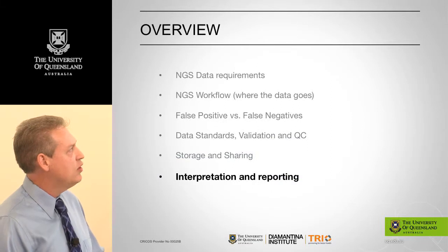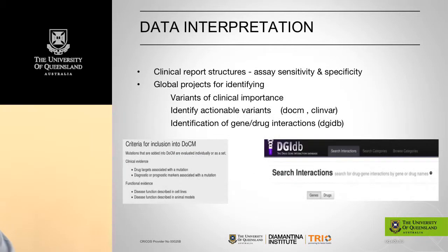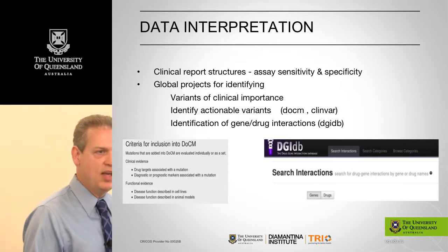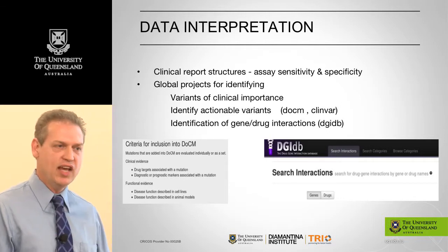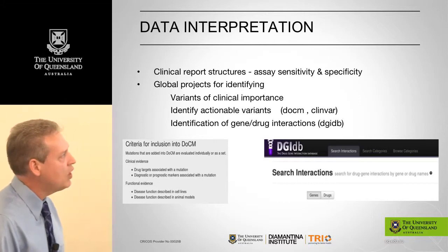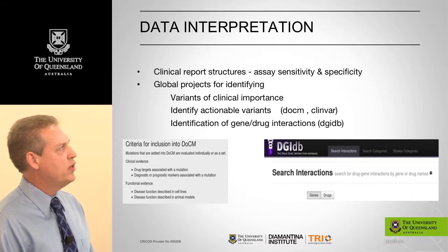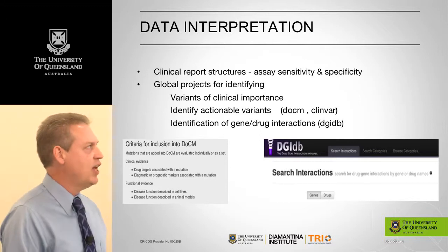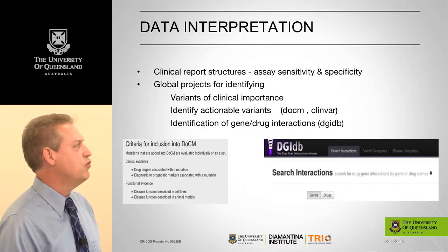So, interpretation and reporting. We've done a lot of work collaborating with PA Pathology here on developing clinical report structures. A clinical report has to go to pathologists, because only pathologists can give an interpretation of the data. So we're building our report structures to work with pathology. This is relatively straightforward if you know what you want to measure: I want to measure these genes and these mutations. So this is the report structure which we generated.